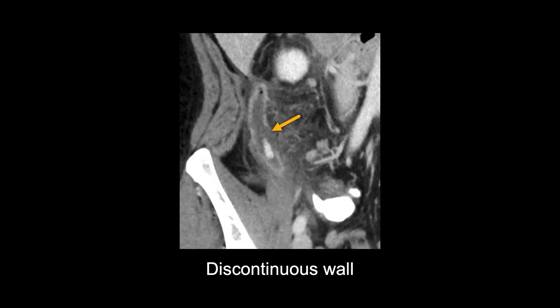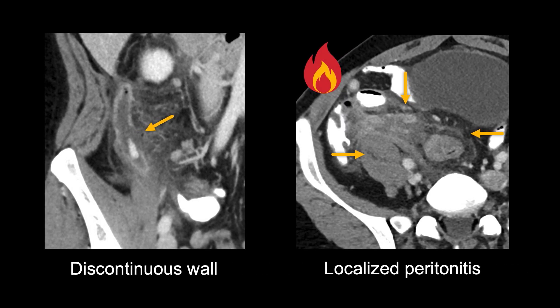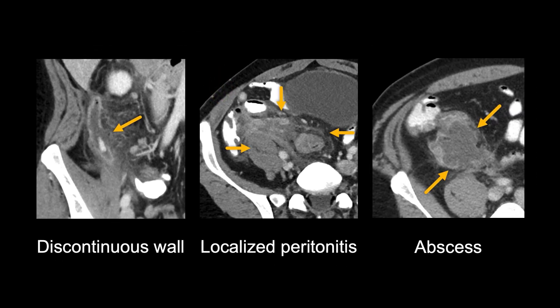There are three essential imaging findings that will help you characterize complications related to rupture or perforation of the appendix. First, the thin, enhancing wall of the appendix will become discontinuous at the site of perforation. You will also see a large amount of inflammation in the right lower quadrant affecting nearby structures, which can be described as localized peritonitis. Lastly, abscess formation will occur from the contents that leaked out of the ruptured appendix — a fluid density collection with a variably thick and enhancing wall depending upon how organized or walled off the collection is.